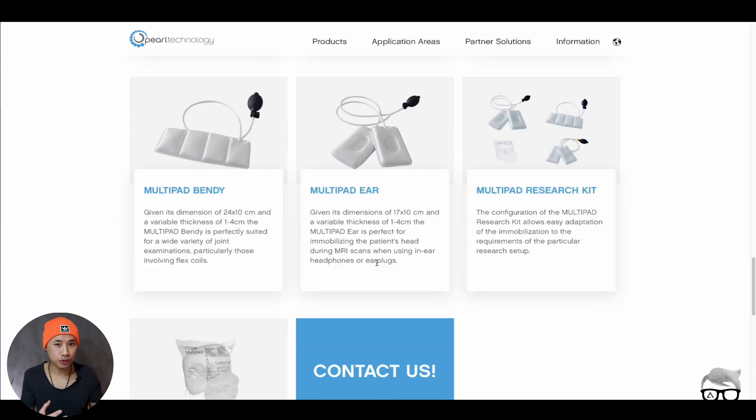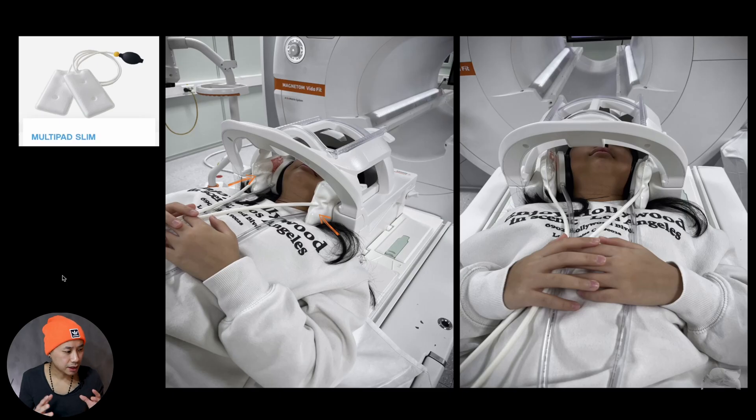Let me show you what we do at the hospital. I brought my daughter with me to work just to demonstrate positioning. You can see there are multi-pads here — this is the multi-pad slim on both sides. It's actually very slim, but I inflated it here. You can see it's getting bigger, so it will fixate the head very well.